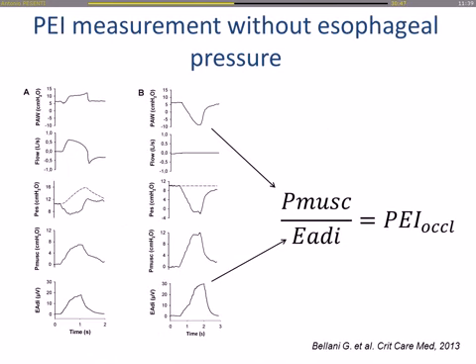if we make an inspiratory occlusion, like in here, in this side, the airway is occluded. The patient inspires. He makes a negative pressure. But the volume does not change because the airway is occluded. So if the balloon is properly positioned, changes in the airway pressure equal the change in the pleural pressure.